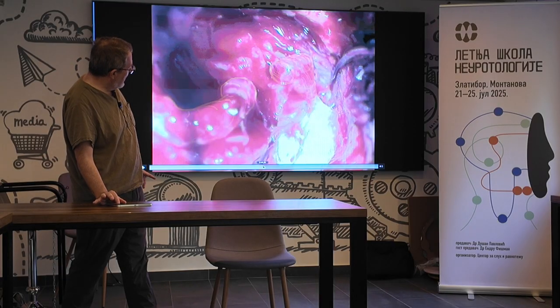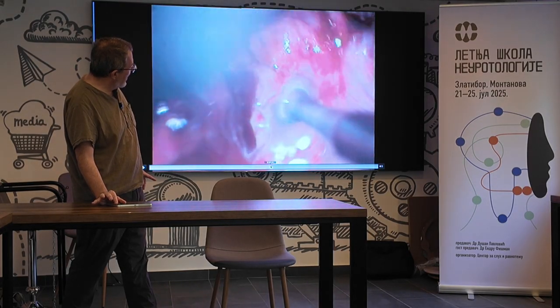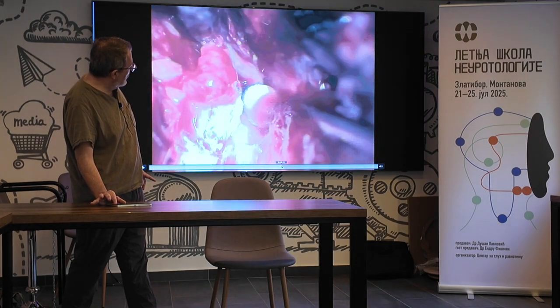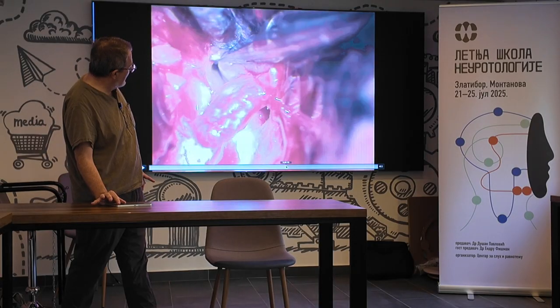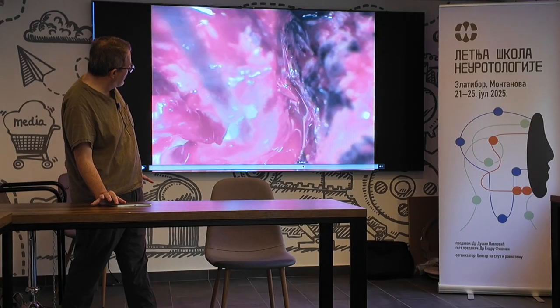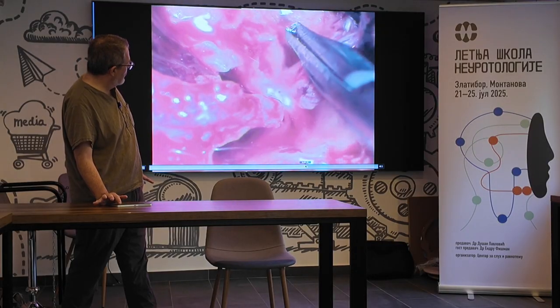Clean them up, and then move this nerve back by taking the bone all around the internal auditory canal, and move the nerve back so I can nicely make a single anastomosis and just put a few sutures. I'll show you that here. It's clean, and now I'll put a stitch.